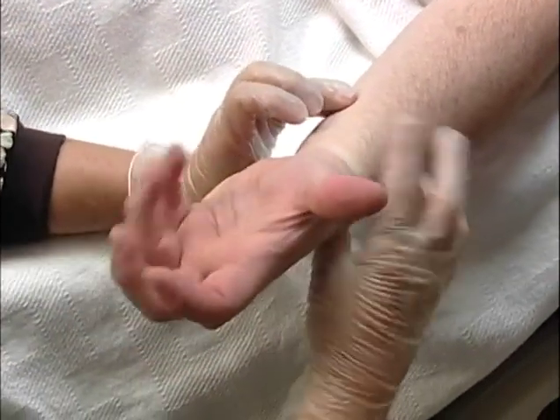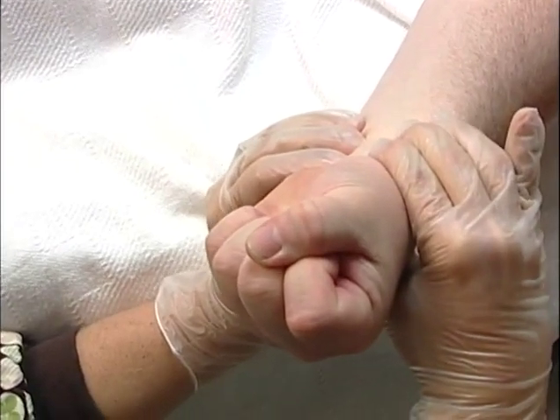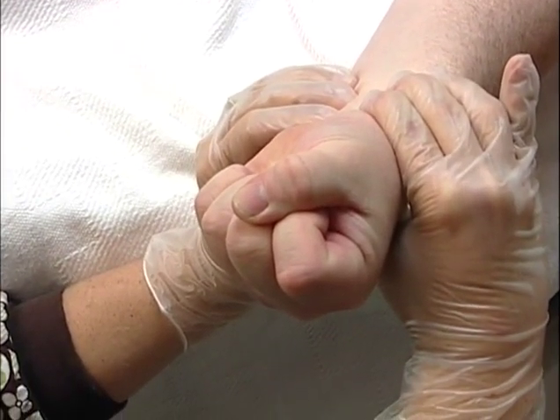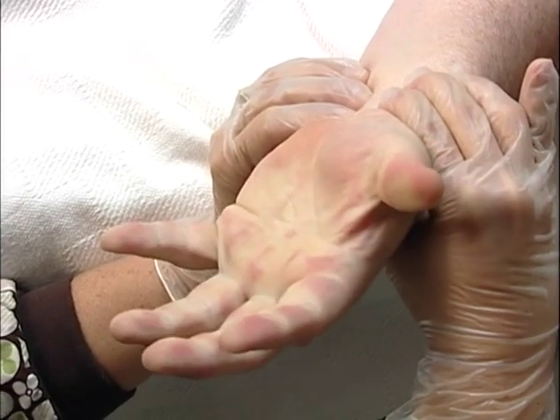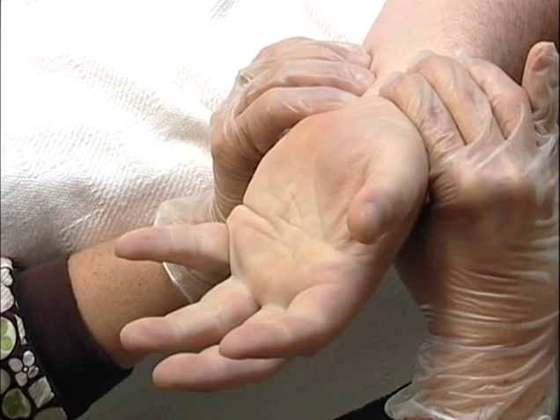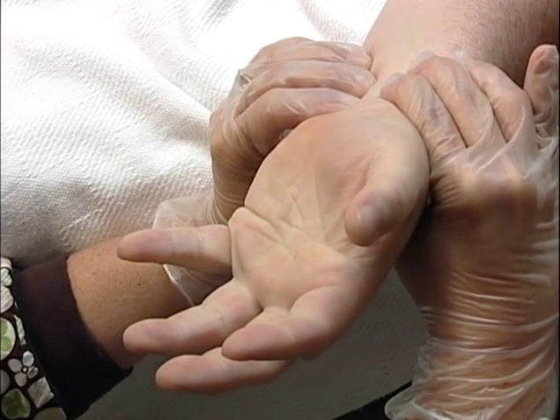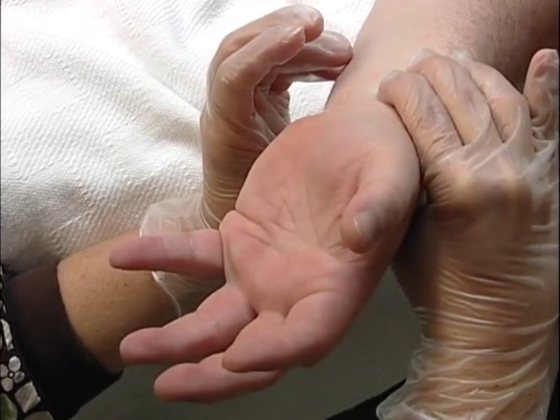Instruct the patient to form a tight fist. Apply pressure at the wrist, constricting both the radial and ulnar arteries. Tell the patient to open his fist. If the palm and fingers remain pale in color, circulation has been successfully obstructed. Release pressure from the ulnar artery only and observe the palm.